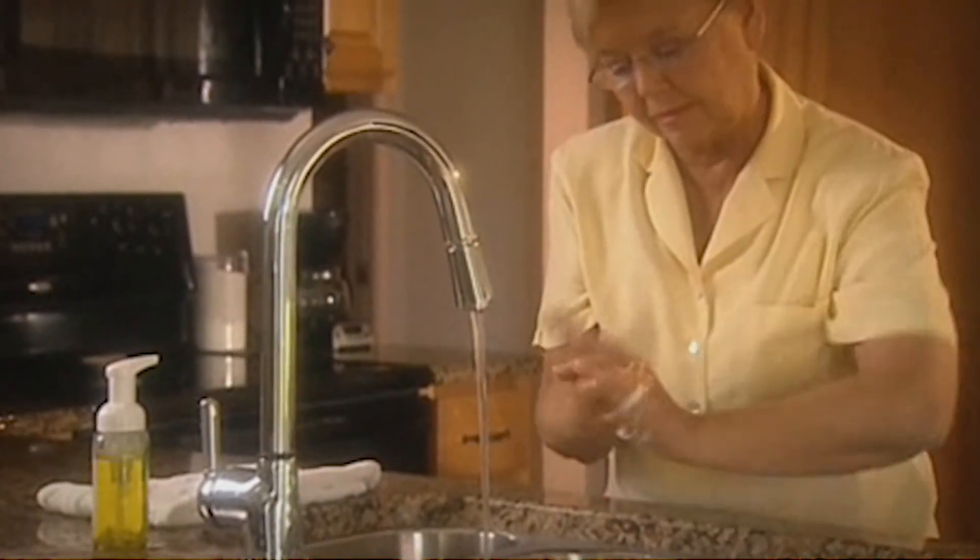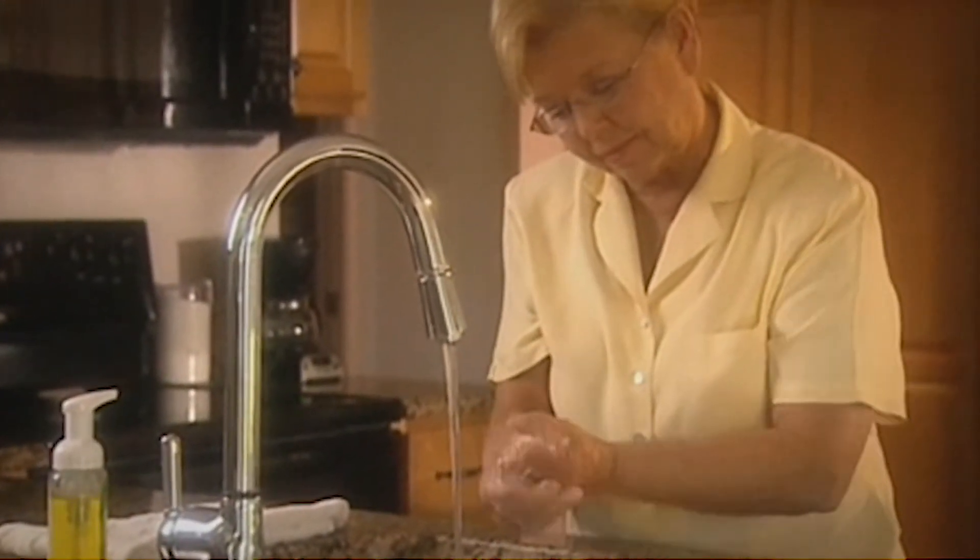Always wash hands with warm, soapy water. Rinse well and dry thoroughly.